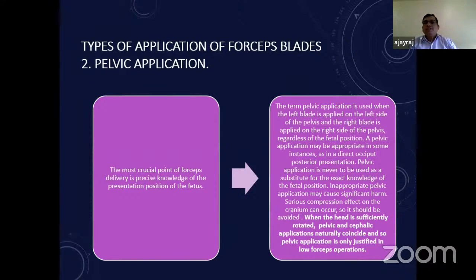A pelvic application may be appropriate in some instances, as in direct occiput posterior presentation, but pelvic application is never to be used as a substitute for the exact knowledge of the fetal position. Inappropriate pelvic application may cause significant harm. Serious compression effect on the cranium can occur, so it should be avoided.